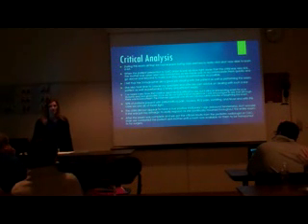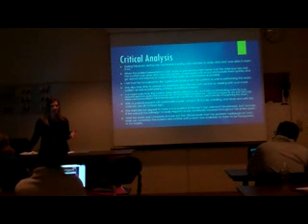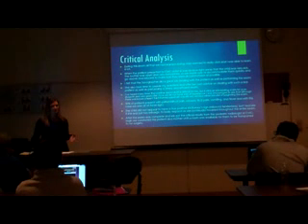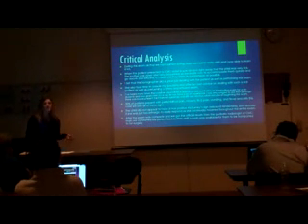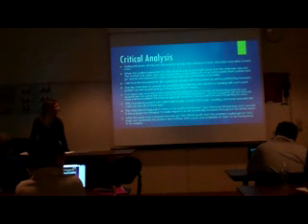As we were imaging the appendix, I noticed that even though there was a lot of bowel present, it didn't take that long to actually see the inflamed appendix. It seemed pretty easy to recognize, which I've heard sonographers tell us multiple times: when it is actually inflamed, it's not as difficult to image. So that was encouraging to me, not for the patient, of course, but that it was pretty easy to recognize, even with all the bowel that was present.